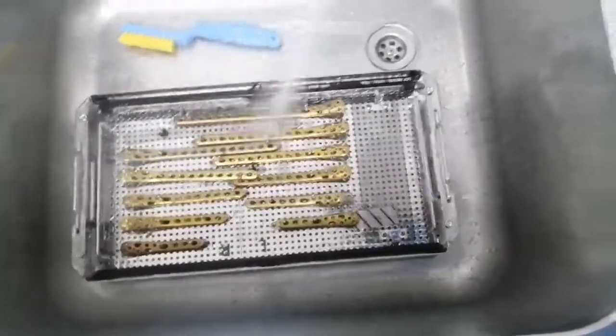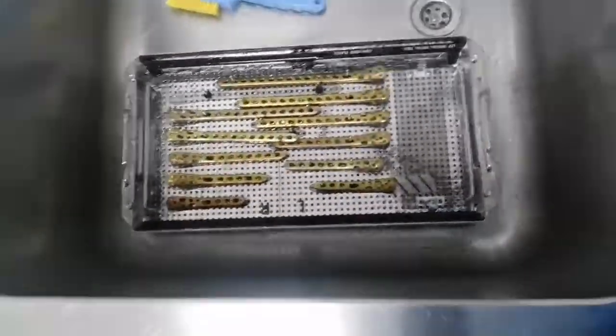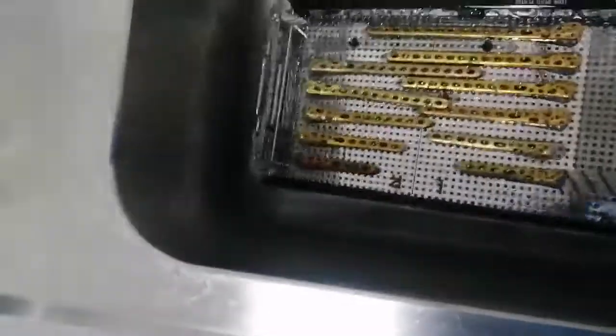I'm using the pressure water to remove the blood from instruments before submitting them to the ultrasonic cleaner.